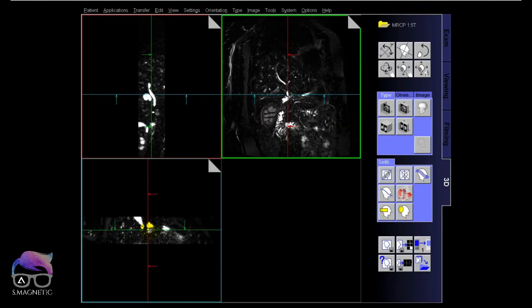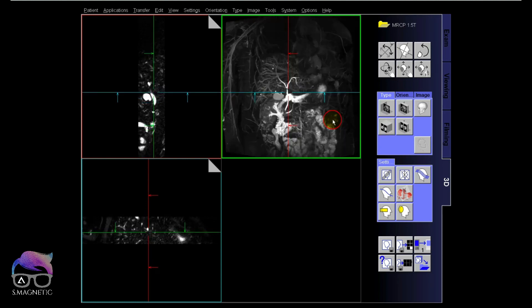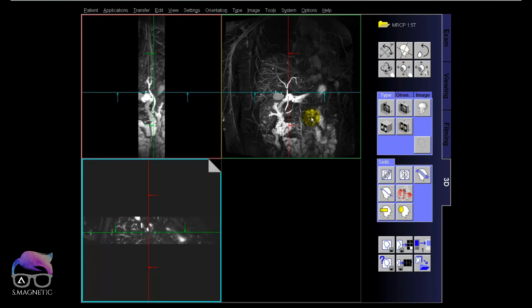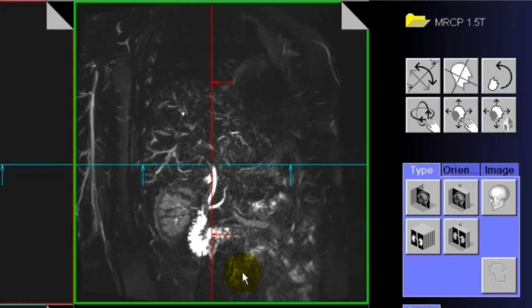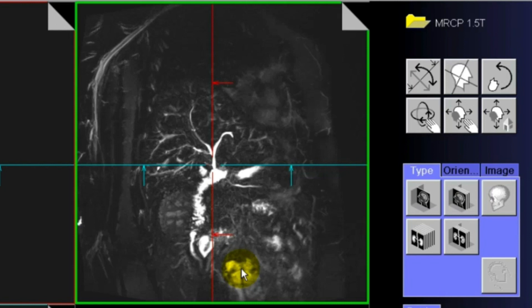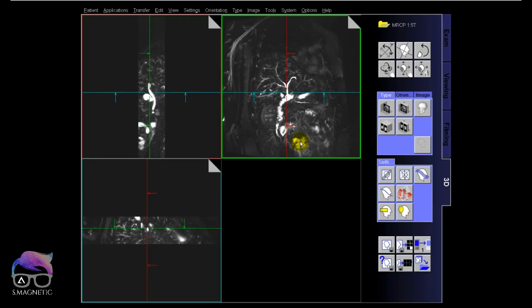Let's check the thin slice images in 3D mode, scrolling through, and then the MIP. The bile duct is bright, the vessels are grey, and the liver is dark. We build this sequence with a TE of around 400, compared to the older approach of around 700 to 800. I find the TE of 400 gives better raw native images — less noise and clearer images — though the MIPs look different from the higher TE approach.